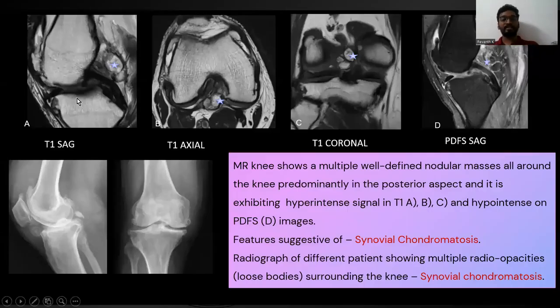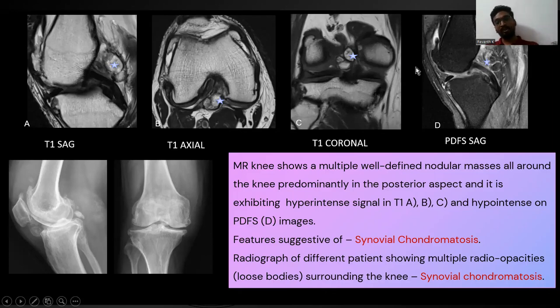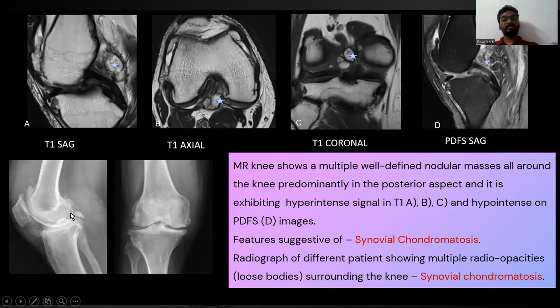In our case, on T1 sagittal, T1 axial, and T1 coronal, a hyperintense mass is seen all around the knee joint, with a larger one predominantly in the posterior aspect. On PDFS, hypointense signal is seen, suggestive of synovial chondromatosis. Another patient's images show multiple loose bodies in the knee, suggestive of osteochondromatosis.